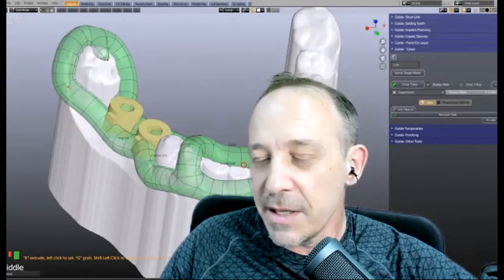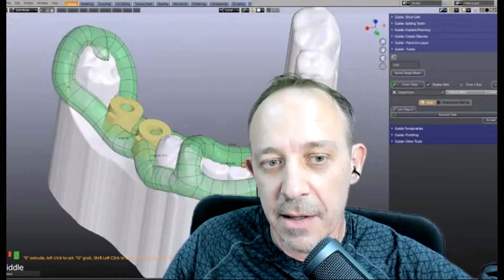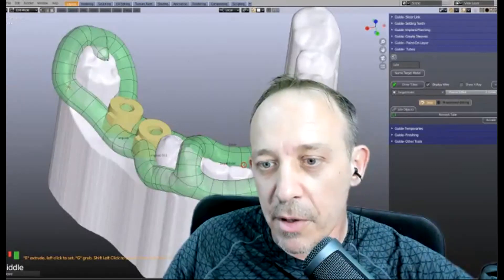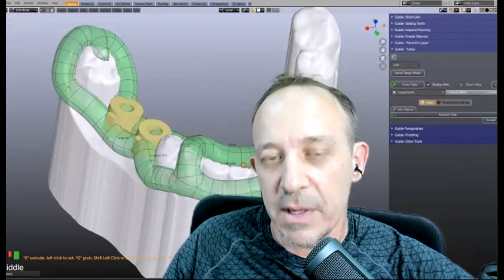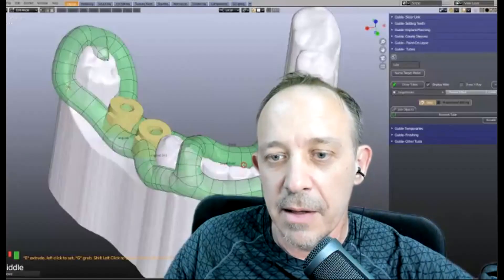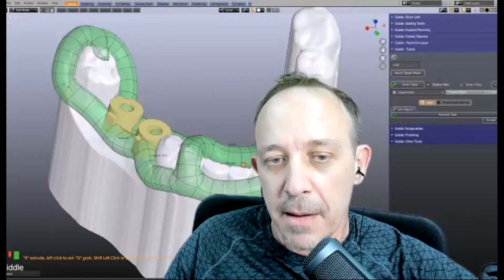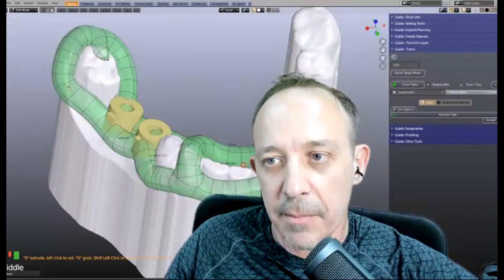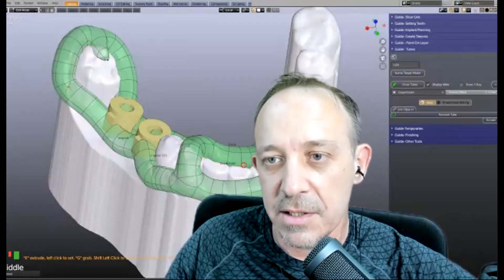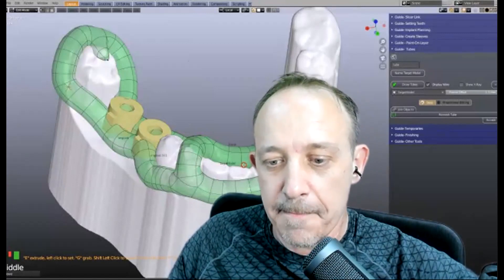Welcome to the session. In this tutorial we'll be using the model designer, the block out module, and the splint designer for making this, plus the articulator. Mike will cruise through it and I'll talk through what procedures he's doing. Before we start, there are many different designs — this is a live patient case.